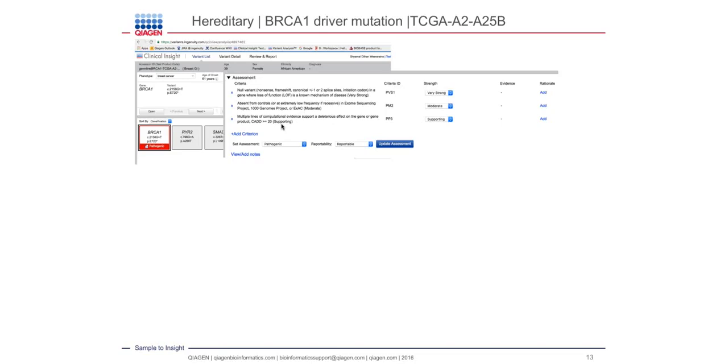Now, one of the questions we had is we started with the assumption, okay, so BRCA1 is more present in cases that are not Caucasian, and here we are. We have a case that is with a demographic of African Americans. So, what about the literature?